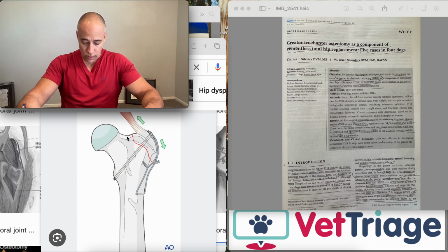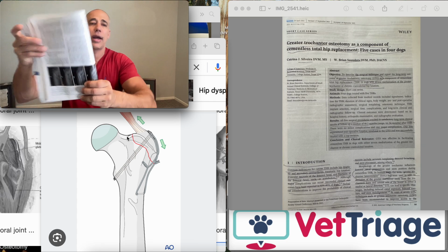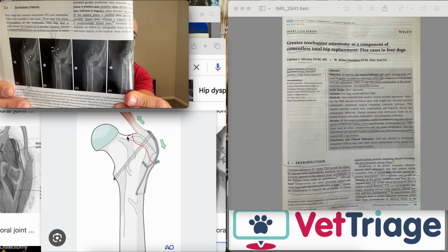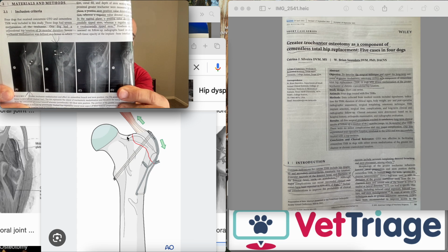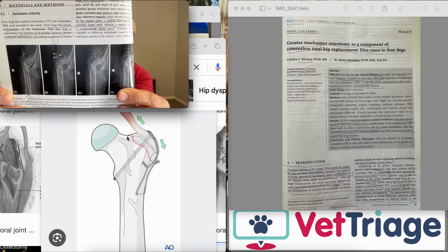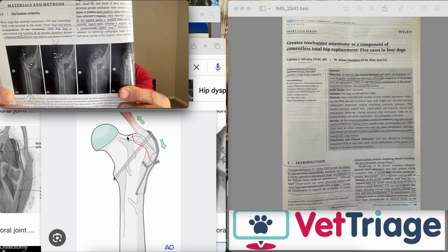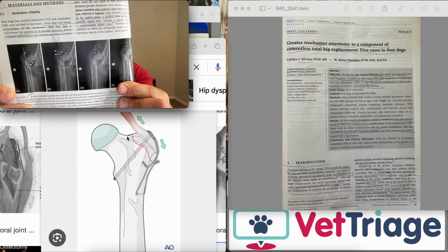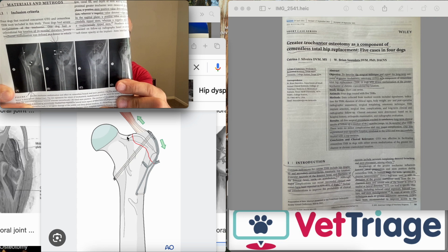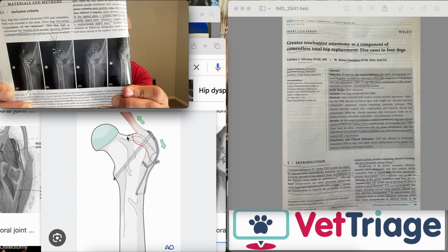The portion of the greater trochanter preventing ideal stem placement was outlined on radiographs. So this is the measurement of the radiographs here from this finger here. You can see the line down the center is the central axis, and you can see that dot where that line intersects. That's where the greater trochanter is in the way. And then the arrows in this picture here is the sclerosis of the femur. Look how white that femur is, thick, dense bone. And then the other 3 images show different variations of what would happen if they did not perform the greater trochanteric osteotomy.